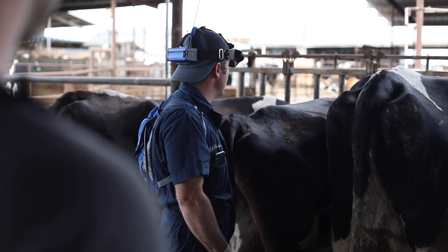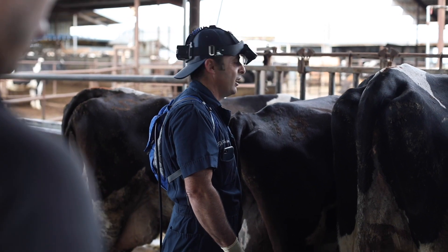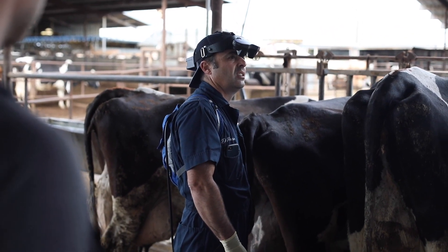I use my EasyScan to ultrasound cattle for pregnancy checks for our regular checks.